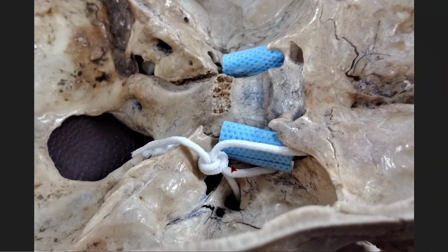Now what I did, I made a model with thread. This is the trigeminal ganglion. This is the trigeminal nerve which is coming here and forming the ganglion at Meckel's cave. These are the three branches. This is foramen lacerum, foramen ovale, foramen spinosum.